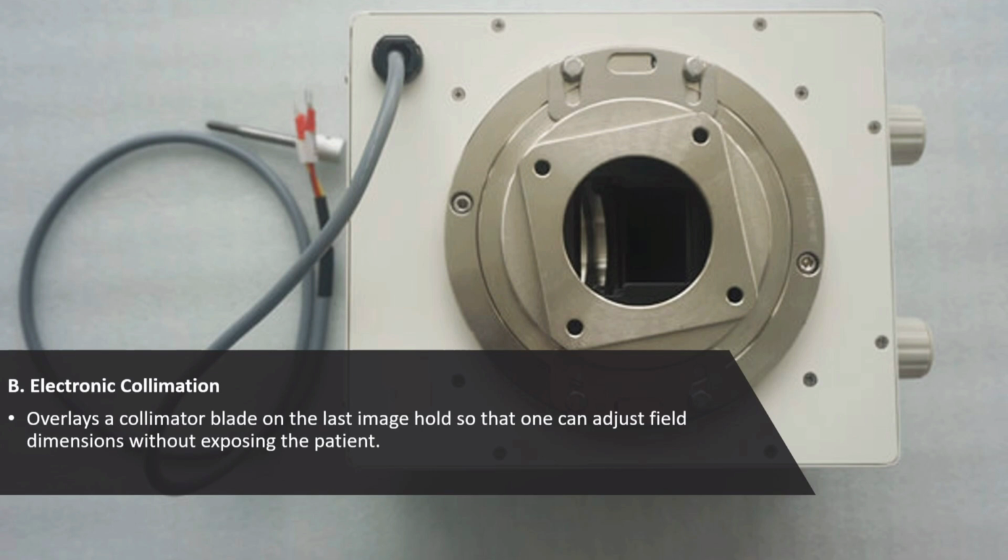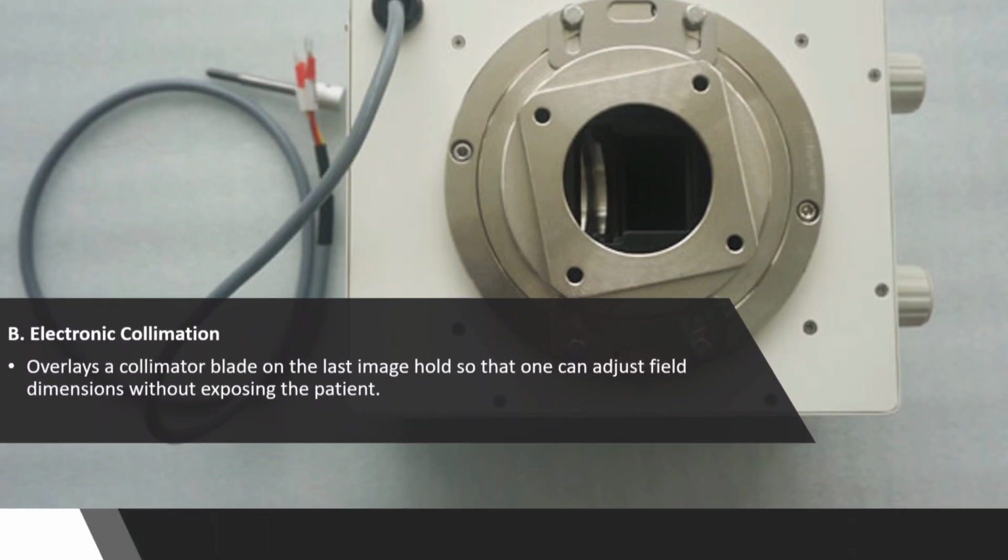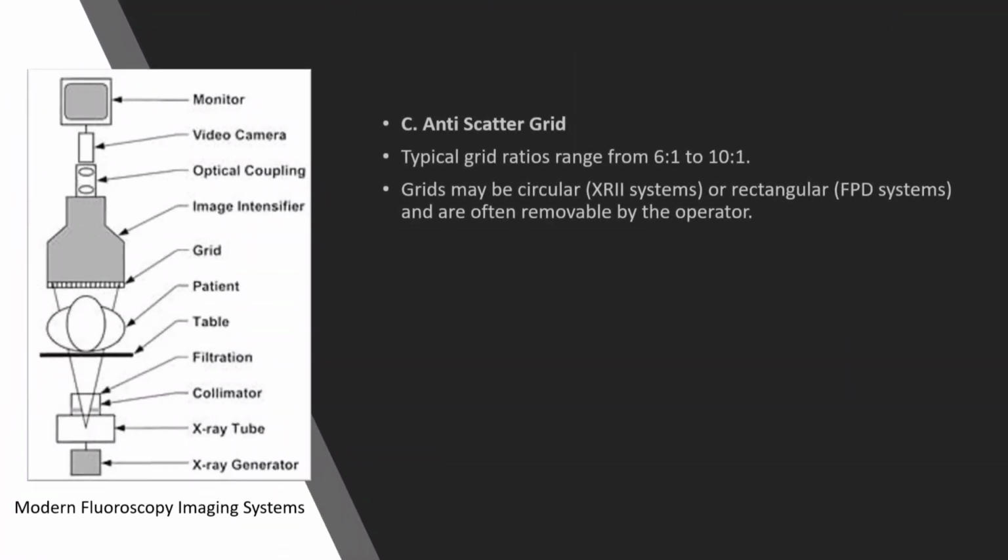The next one is electronic collimation. It overlays a collimator blade on the last image hold so that one can adjust field dimensions without exposing the patient. Next, we have the anti-scatter grid. So the typical grid ratios range from 6:1 to 10:1, and this grid, depending on the system, could be circular or rectangular and often removable by the operator.